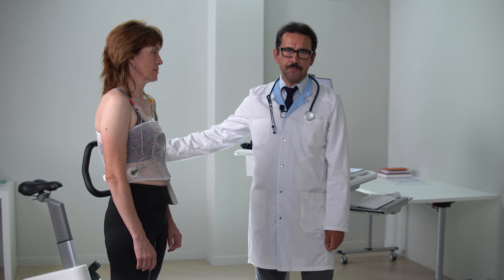Today, I would like to present to you an exercise stress test using a cycle ergometer for diagnostic purposes. First of all, we need to do a small check with our patient, Tatiana, to see if we have any contraindication to the following test.